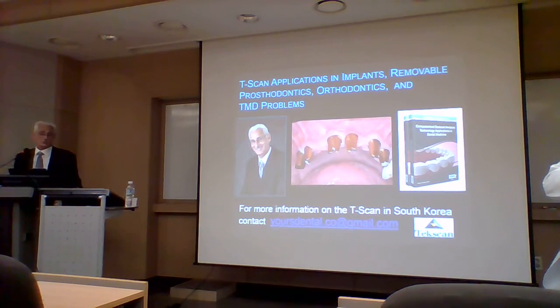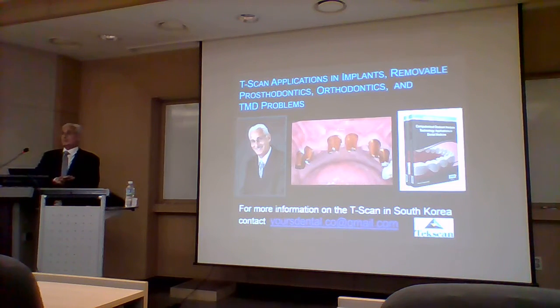But it's a good question. I spent a lot of time in Canada. There's a group that does all-on-4, all-on-6 restorations. It's all they do. And they were having a lot of trouble with these restorations, breaking them, patient discomfort after insertion. So they asked me to come with the T-scan and help them. And when we gave these all-on-4s, all-on-6s anterior disclusion rather than group function, the patients were like, wow, that's a lot easier to move, it's much simpler, it doesn't feel as bad. And when we used the EMGs on them, the muscle activity went down.